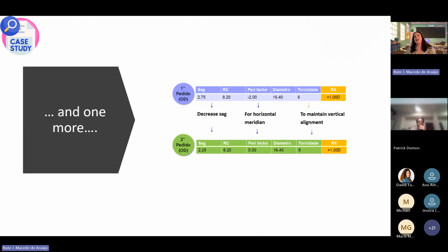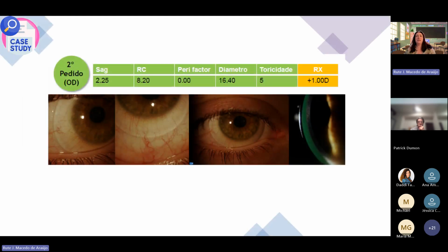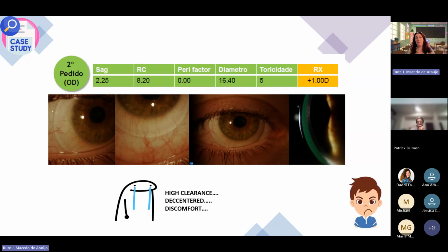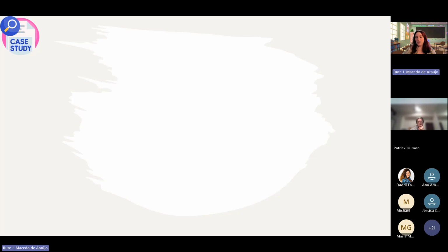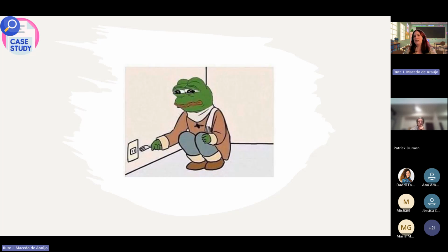We decreased the sag, and we made some adjustments in the periphery. And what happened? It seems like nothing happened. High clearance, lens decentered, patient with discomfort, patient unhappy. So these are sometimes the things that happen. Okay, we'll just give up. But then we can rest a little bit and take our knowledge to our practice.